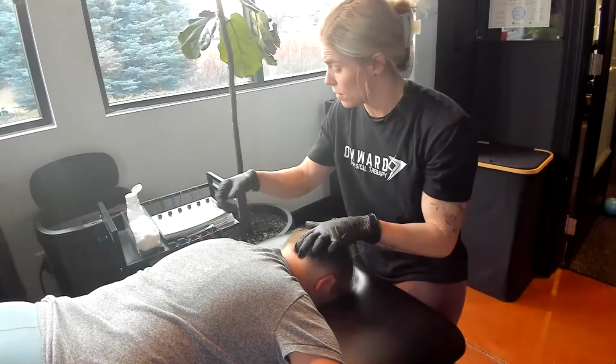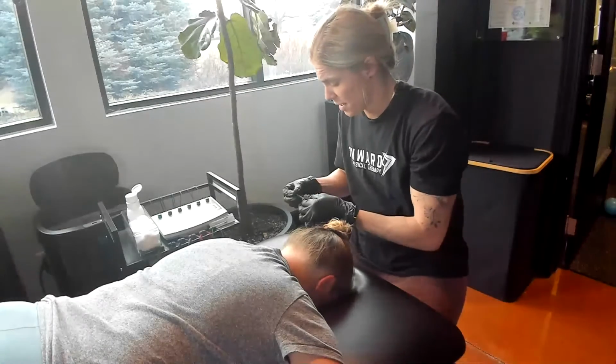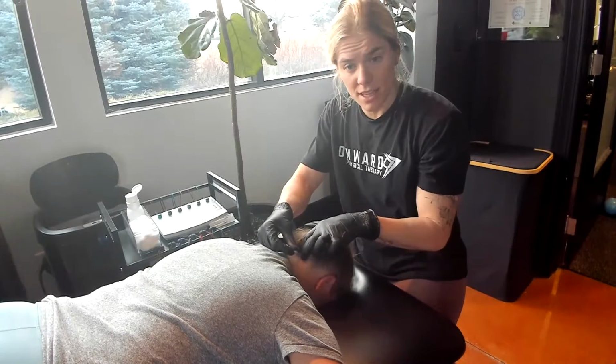Our needle angle, let me just grab a guide tube out and we can kind of go over that. Our needle angle is going to be almost perpendicular to that occiput.